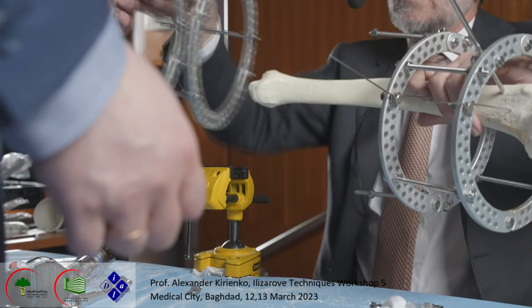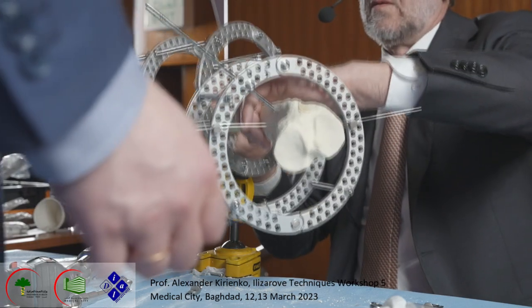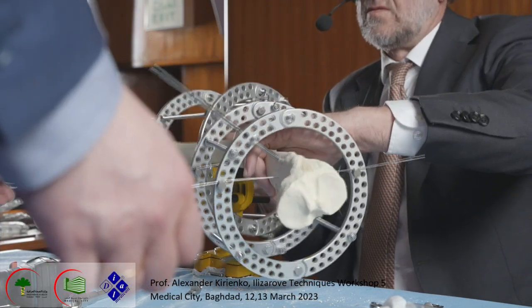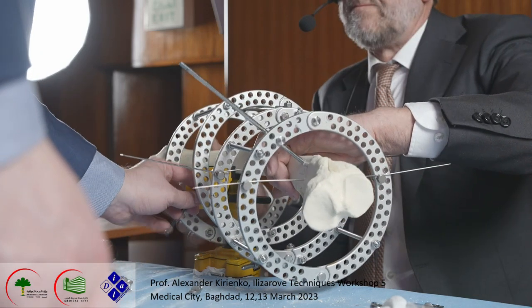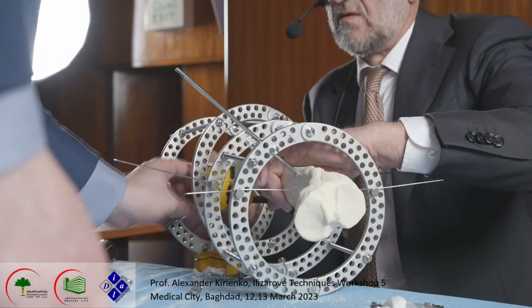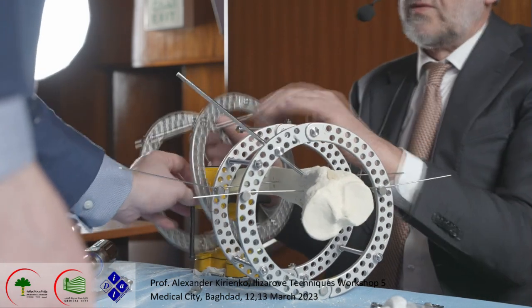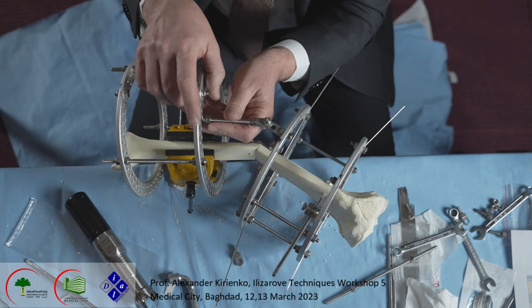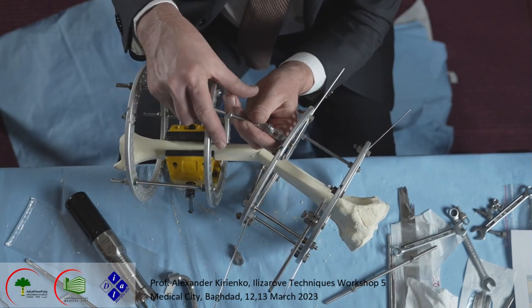Okay, like this. Okay, 1 second, maybe now we should attach. Okay, we put this system in the same hole here.